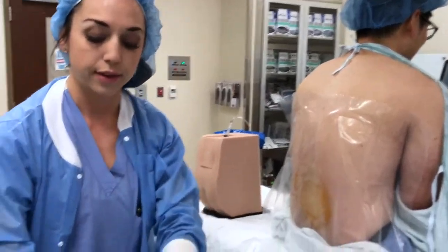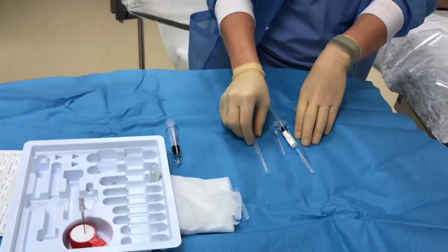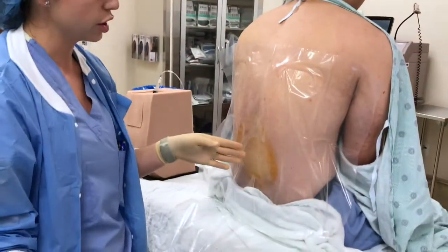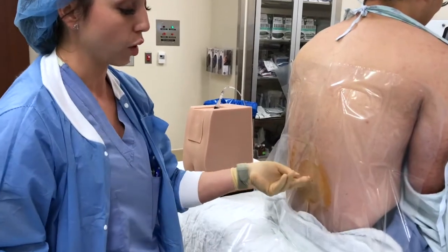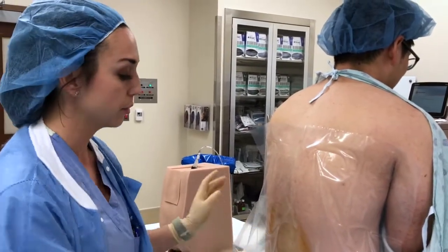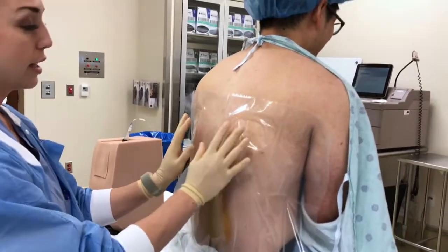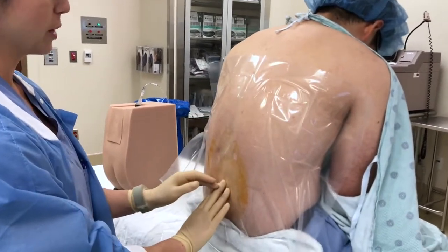Okay. And then this is where I like to reaffirm my anatomic landmarks, make sure that I have all of my equipment within reach so that if needed, you don't have to turn around and grab your medication, that you can keep one hand here and comfortably reach all of your tools and your medicines. All right, so usually I tell the patient, okay, now I want you to assume that nice position, relax your shoulders down, push your lower back out towards me, very good.